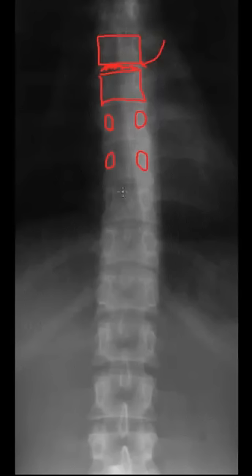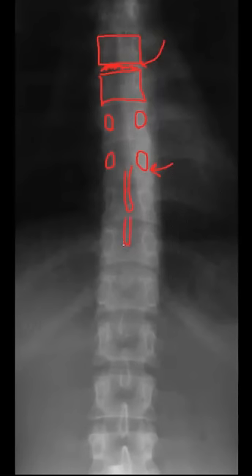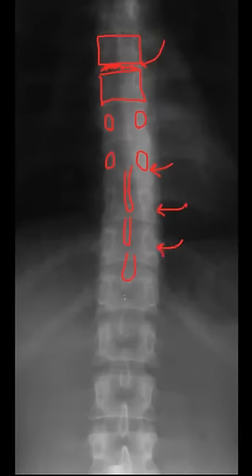Let's continue with spinous processes. Here's a spinous process — apologies, it actually belongs to this vertebra. Here's another spinous process belonging to this vertebra. Here's another spinous process belonging to this segment, and here's the T12 spinous process.